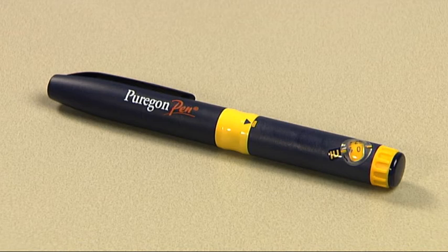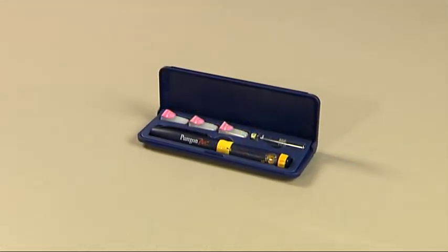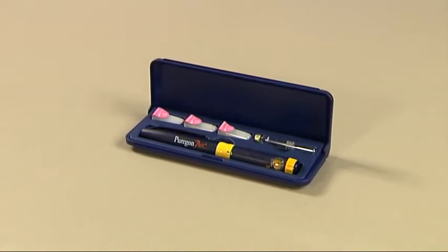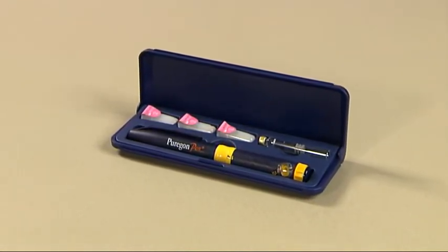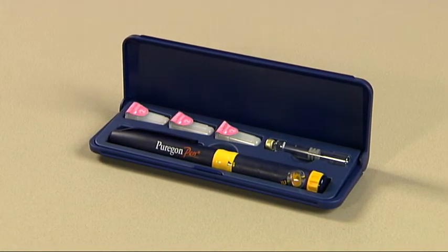Welcome to the instructions for use for the Puragon pen. This presentation will guide you through all the steps necessary to use your Puragon pen. The four main steps are: before you begin, preparing for your injection, giving your injection, and after your injection.